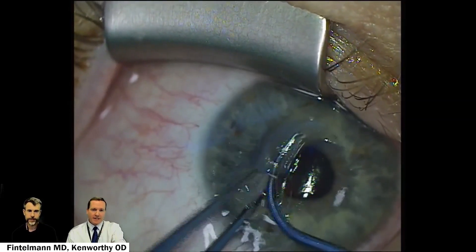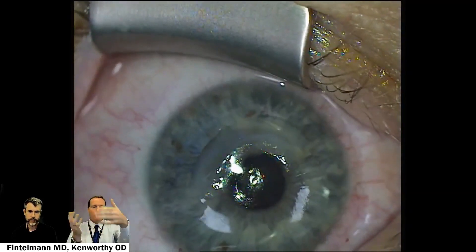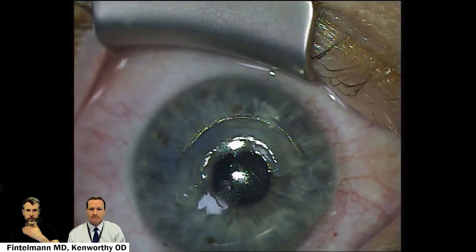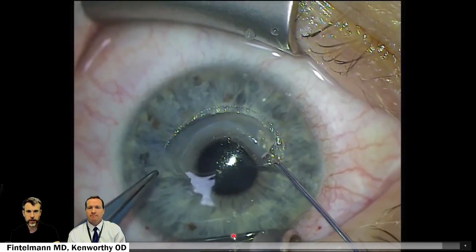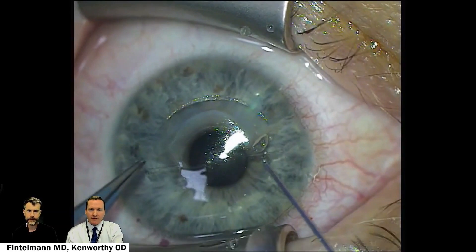As a reminder, this is the inferior cornea where this tissue is being placed, but we're seeing these surgical views, so it looks superior to us. As a surgeon sitting at the top of the head and looking through the microscope, this direction would be towards the patient's feet and this would be towards their head. And finally, getting that tissue perfectly placed.